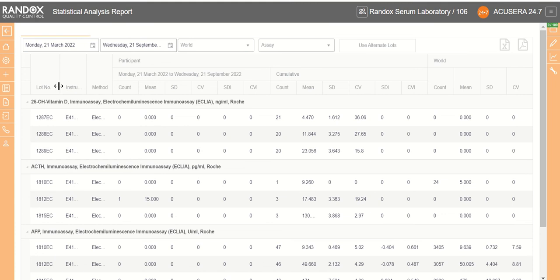We have the lot numbers. We also have the instruments, so the names of the instruments, the method of which the analysis has been done. We have the count, which is the amount of results, the mean of those results, the SD, CV, SDI, and CVI. We have the same thing on this side as well. So our headings are separated in this section into two pieces. We have our participant and our world. Our world is who we are comparing against. Our participant is the user themselves or yourself.